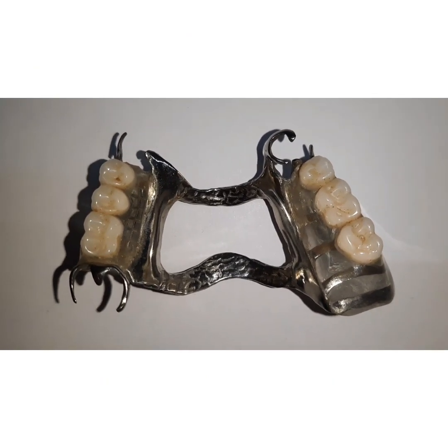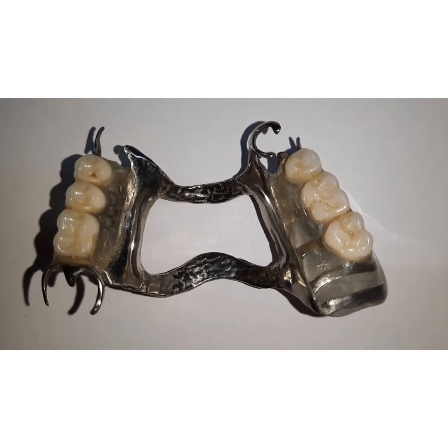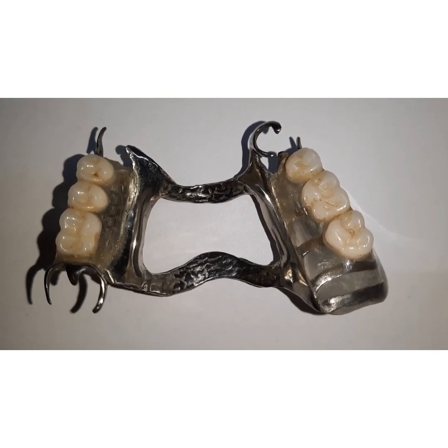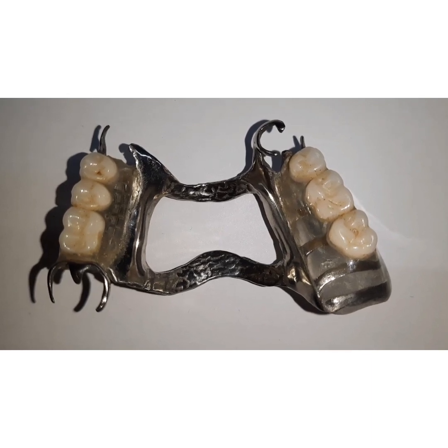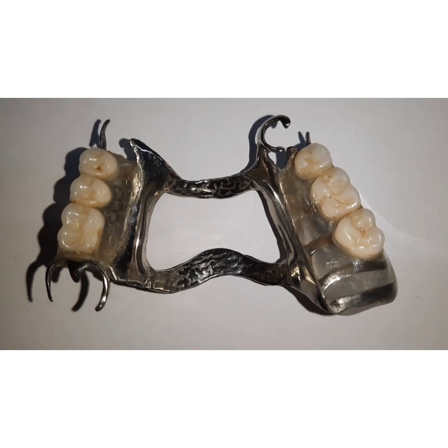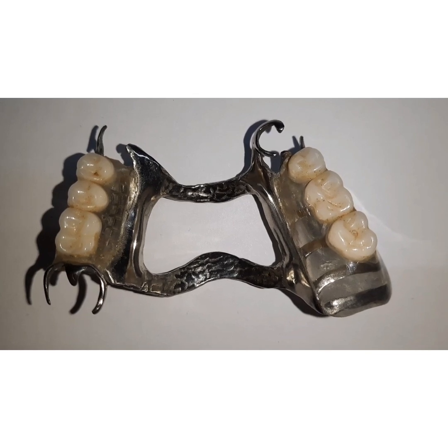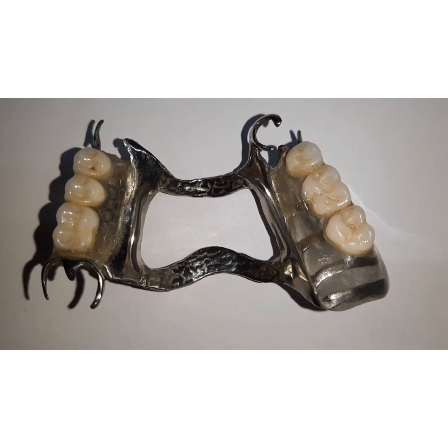Now, majorly at the time of insertion, this is the culmination of the patient's expectation that he is going to get the final outcome. He gets to see the final outcome of his treatment and of the dentist who has planned the processes to ensure accurate fit, proper retention, aesthetics and comfort. Now, troubleshooting in cast partial dentures can be at the time of insertion and it could be during post-insertion.